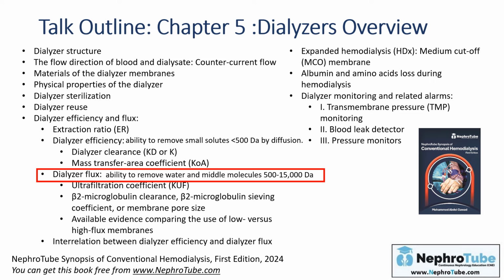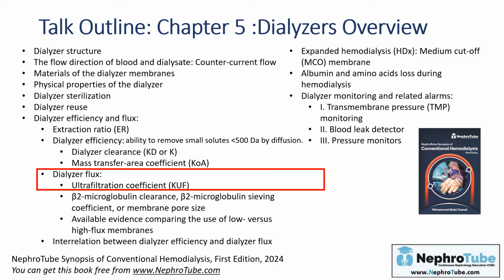How to measure the dialyzer flux? First, by what is called the ultrafiltration coefficient.